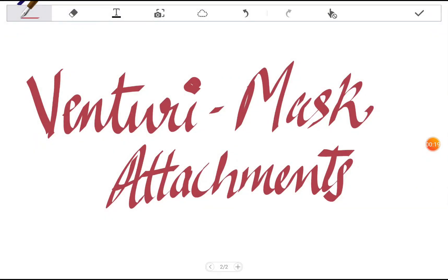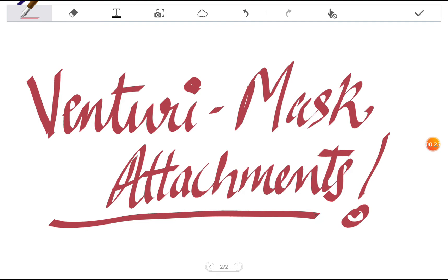It is about Venturi mask attachments. These attachments are the ones which are attached to the oxygen Venturi mask, which delivers a varied amount of oxygen by its attachments. So let's just go on to the topic and see what all those attachments are.